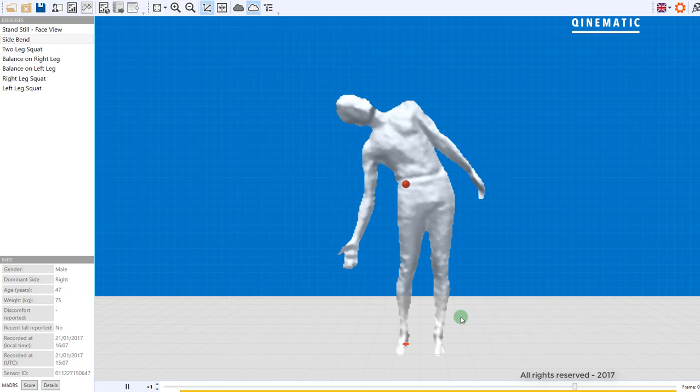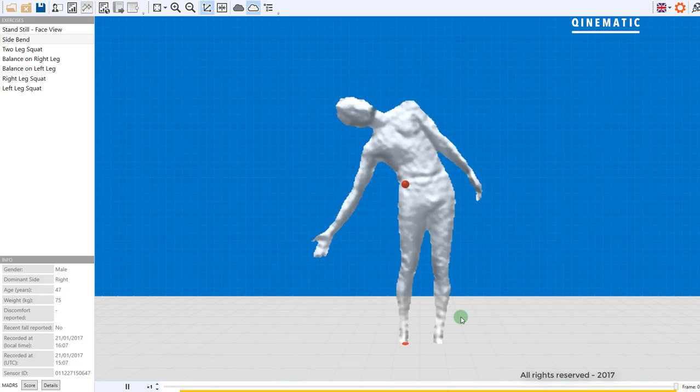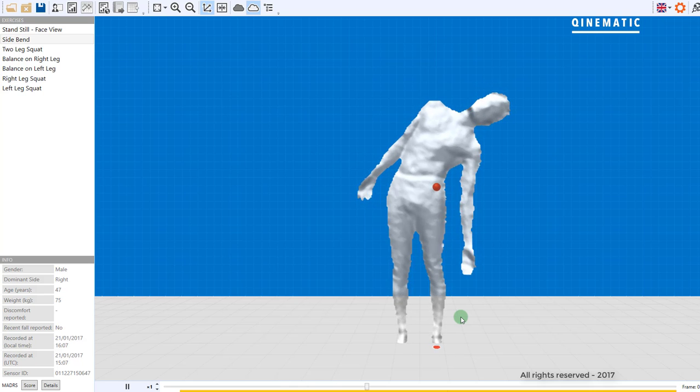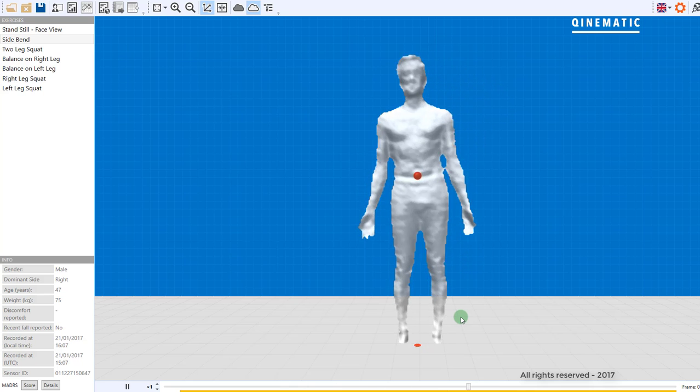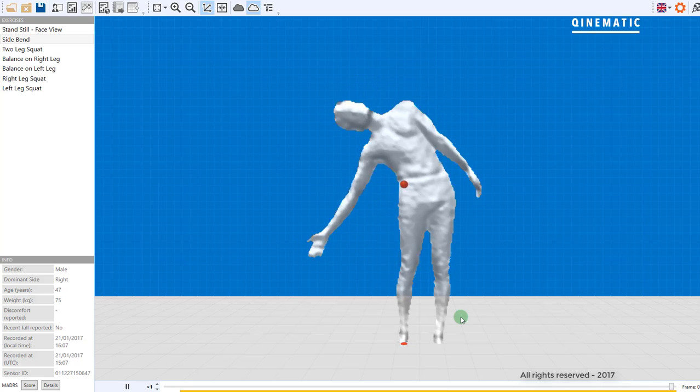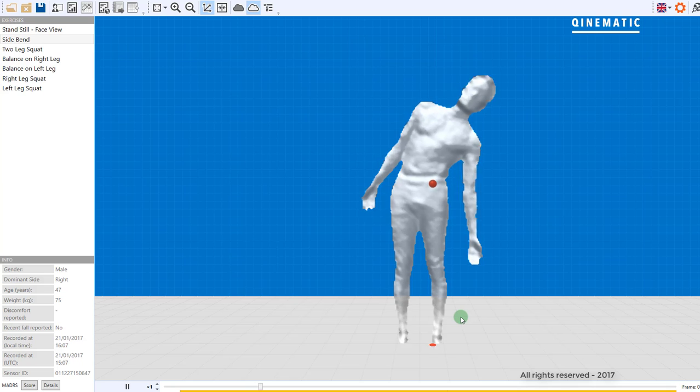And by looking at the way people move and quantifying various body parts, you can explain why they lose balance, why they prefer one side instead of the other, or even the effect that golfers had on them over many years of playing golf one-sided.